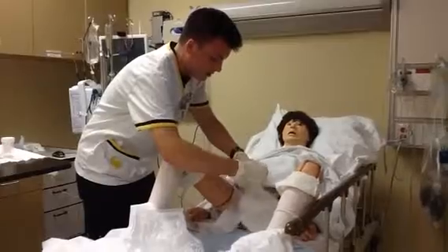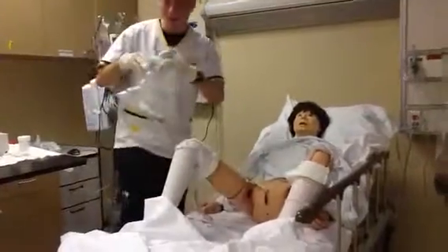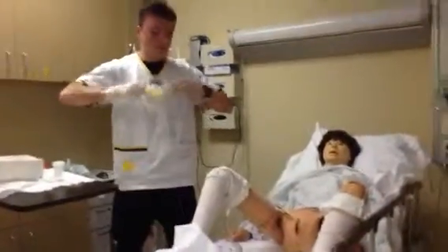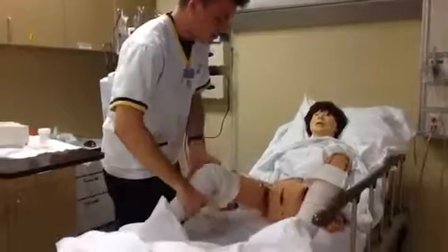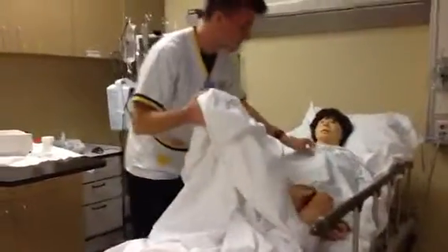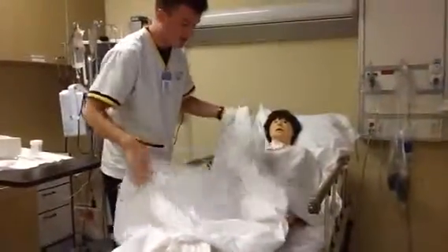I will, at this point, tear my drape off, collect this drape, put it in the trash, and I'm no longer sterile, but the procedure is over. Say, alright Mrs. Knight, thank you. Over the legs, over that. Bed rail up, and the catheter has been inserted.